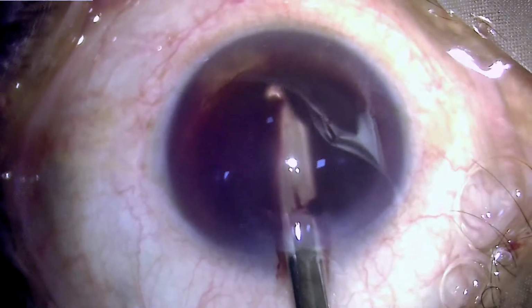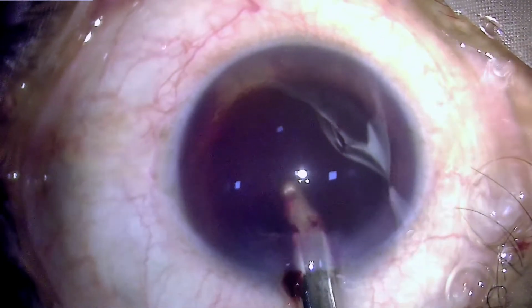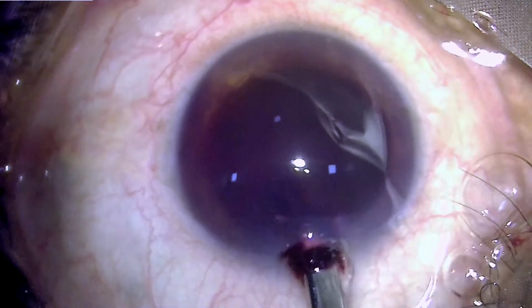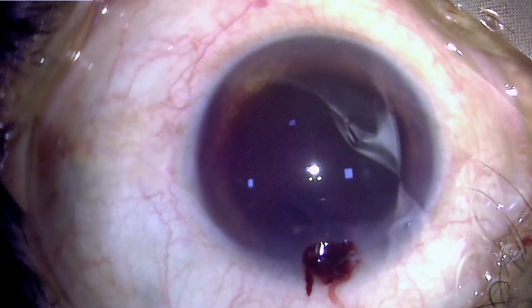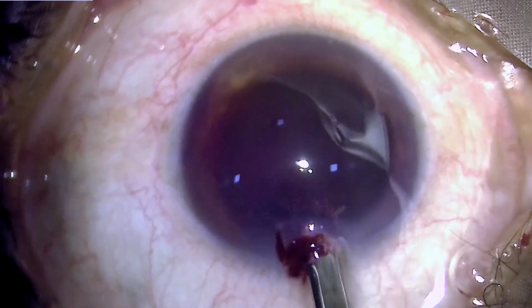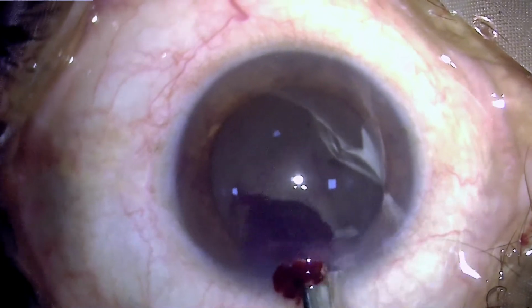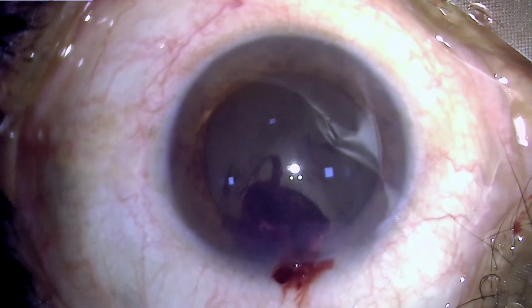Once we have nearly the whole of the clot removed, and the clot has been cleaned out, the glow appears, and it is not uncommon for these eyes to have some abnormality. So it is very important to counsel these patients about the possibility of a recurrent bleed, maybe because of iris vascularization.